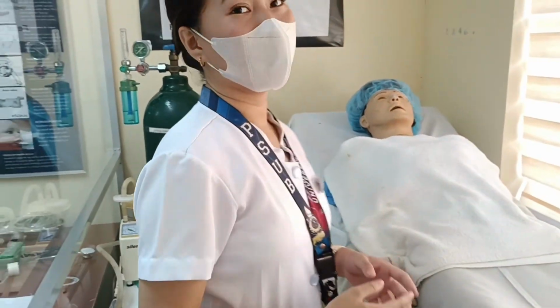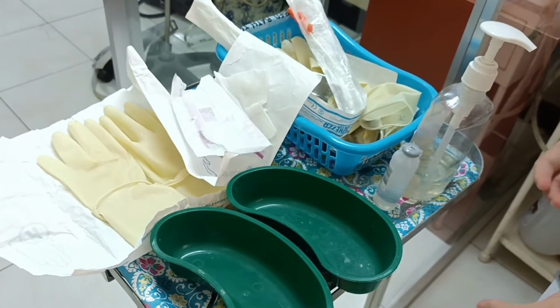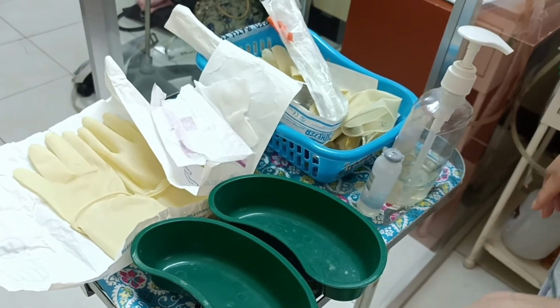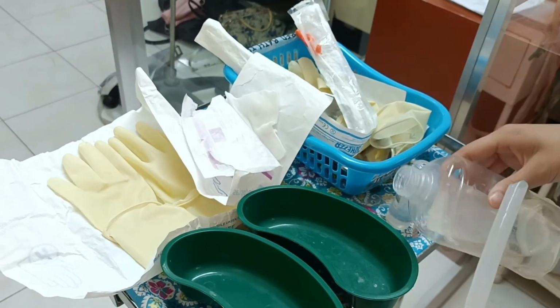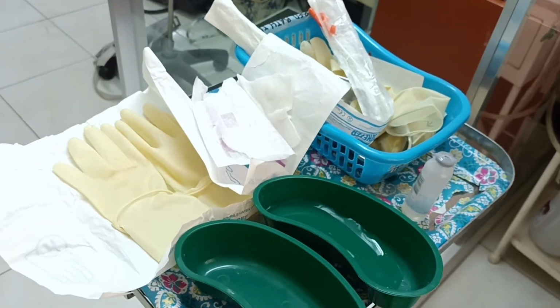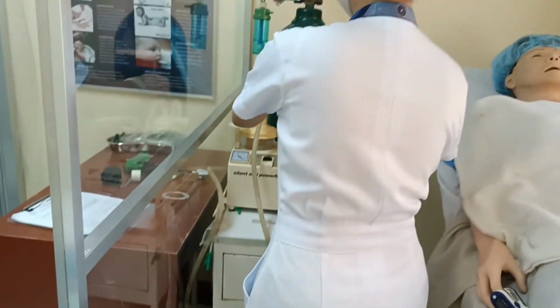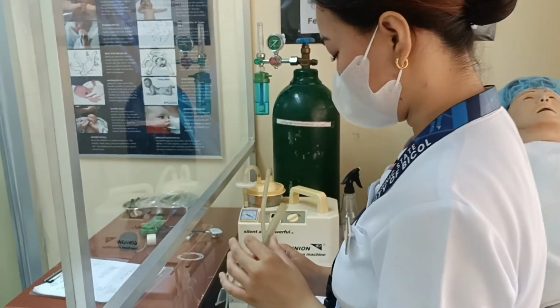Okay, next, we are going to open the sterile equipment. So, it is already open. And then, we are going to indicate the date and time we open it. And we are going to put NSS solution or sterile water in the basin. Then open the suction machine. Then test.